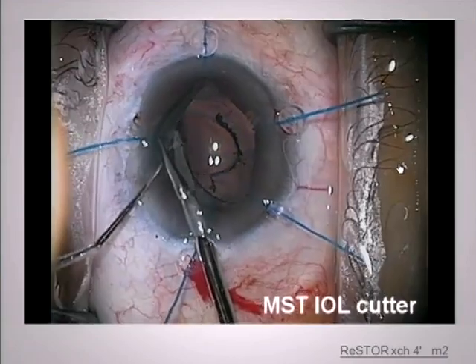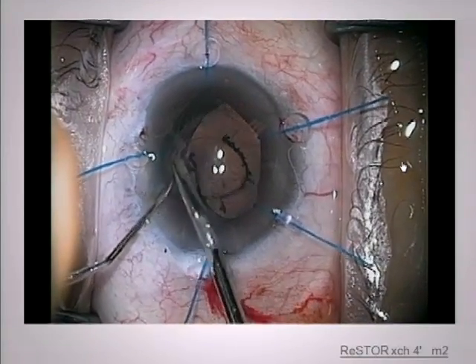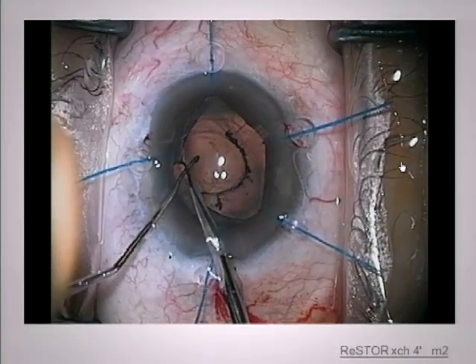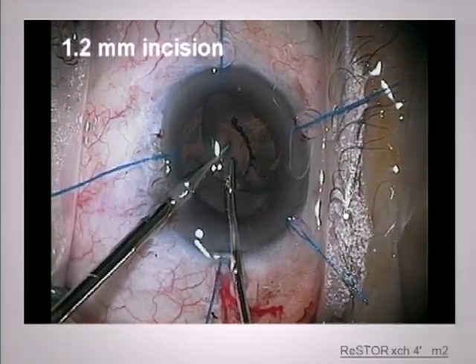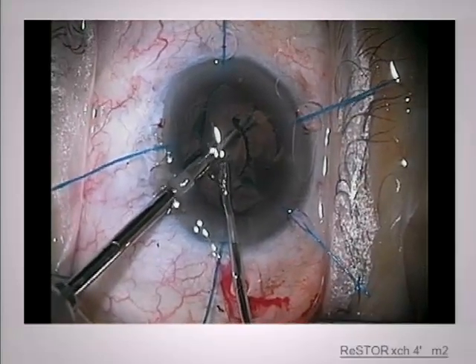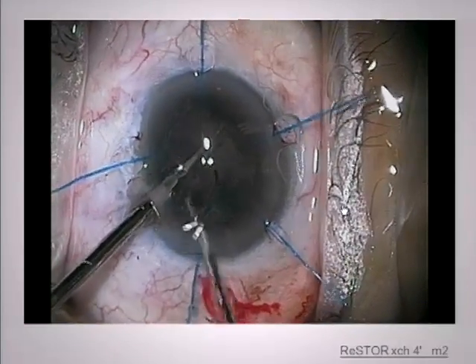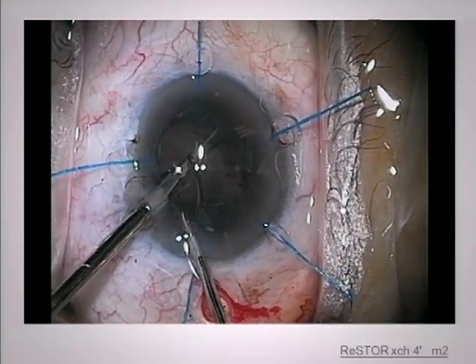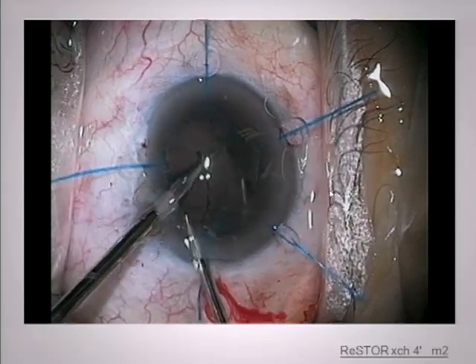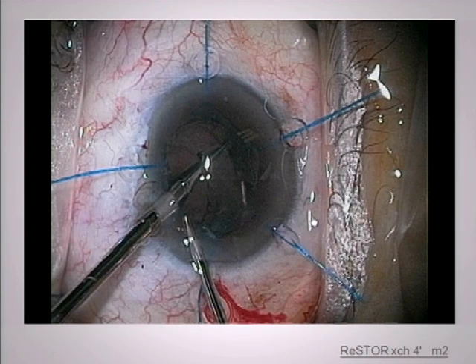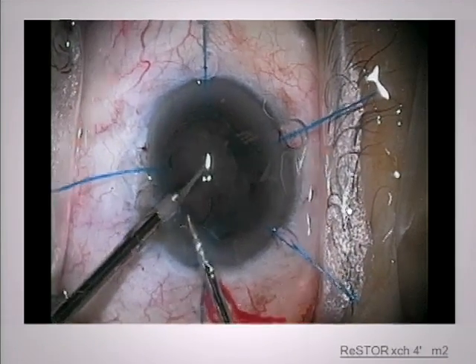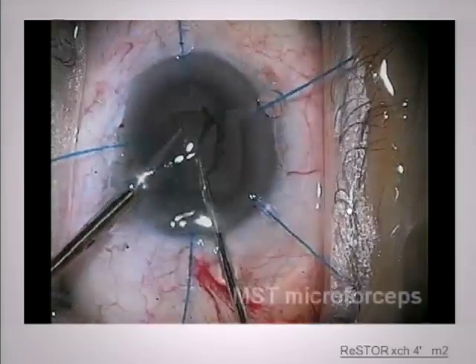This thing is really fibrosed in there. The fact that my posterior capsule is open tells me I don't really want to forcibly distend the equator. I'm coming in with a bevel, cutting with the bevel so that you have somewhat of a beveled edge. These are the MST cutters, and this is actually a 1.2 millimeter incision. You have the option of coming in through a separate port from your IOL incision. I'm actually cutting this inside the bag. The advantage of the design is that as you open and close the blades with the sawing action, you're not distorting the incision or letting viscoelastic burp out.